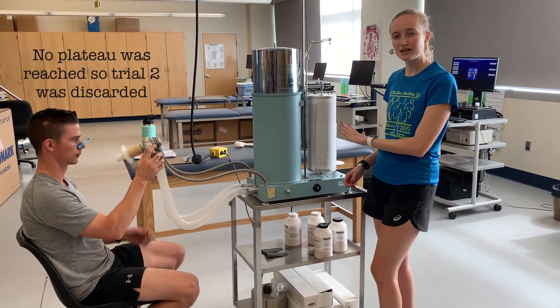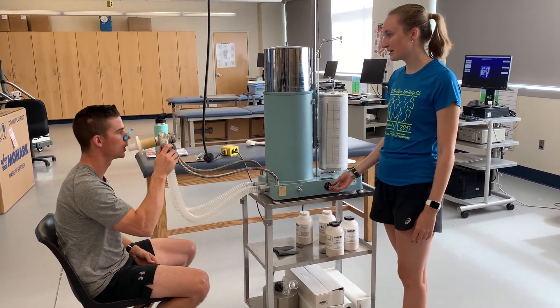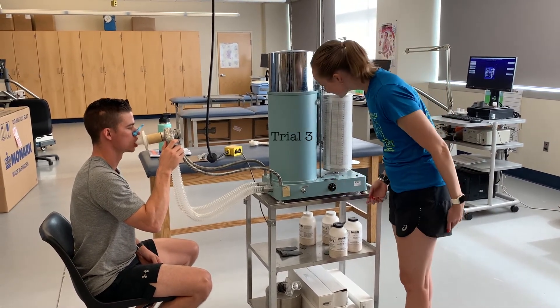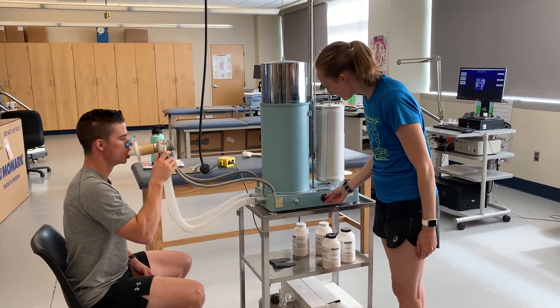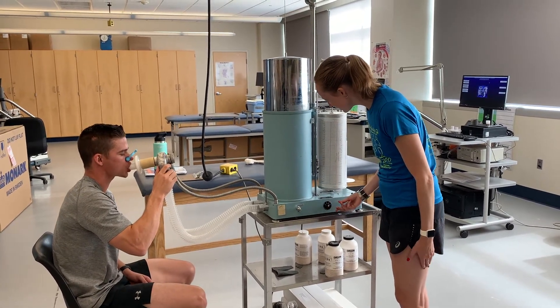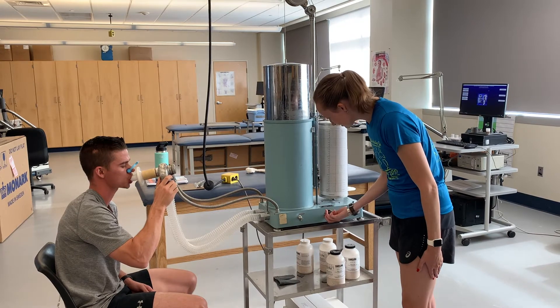We're going to go ahead and do another one — we're not quite sure if that last one plateaued all the way, so we'll do one more. Whenever you're ready, start with just those normal inhales and exhales, then go ahead and take that nice deep breath in and push all that air out. Keep going, push, keep going — good job.